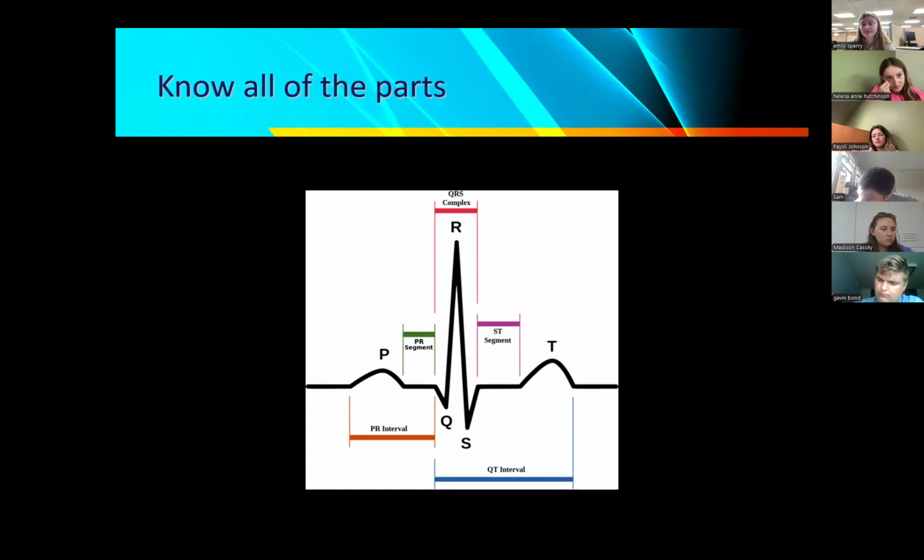Now, again, what we're looking at on the slide here is a classic EKG complex. Here's the thing you got to remember: your QRS can go up above, with the vast majority of it above the baseline. And remember, the baseline is literally just that area in here. This right here is our baseline. That right there is our baseline. Here's more baseline. And so this just simply says that this particular QRS is one view of the heart.